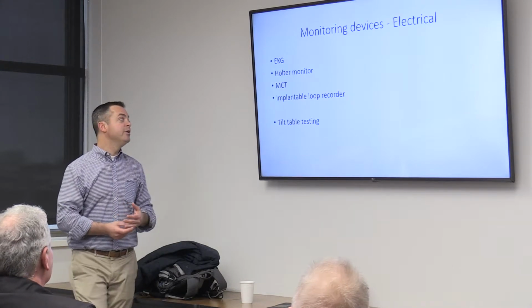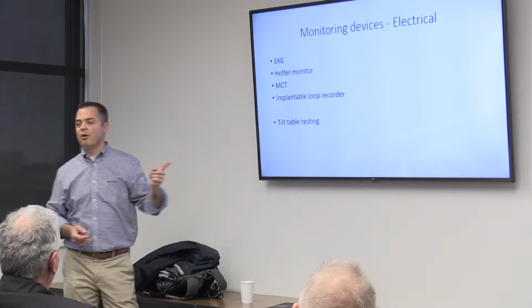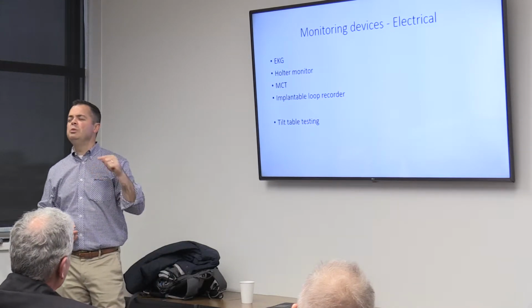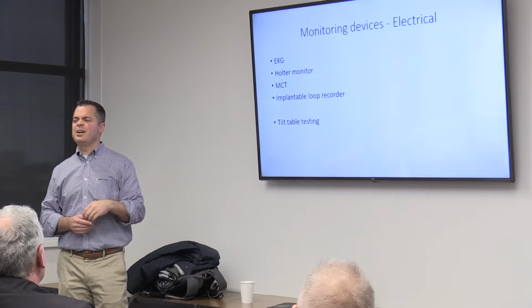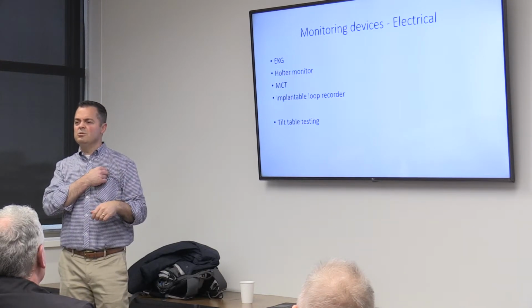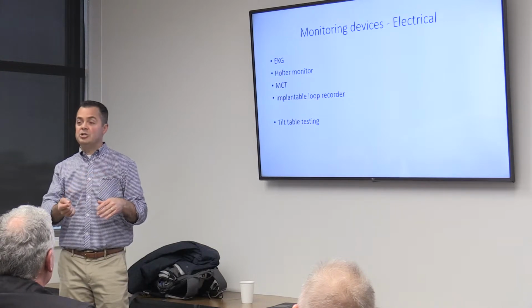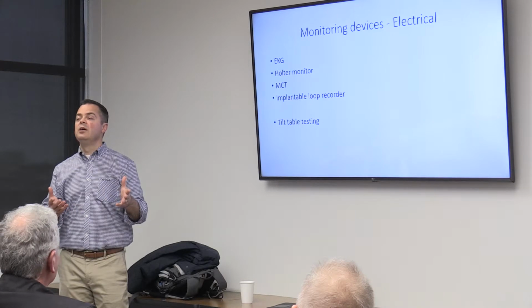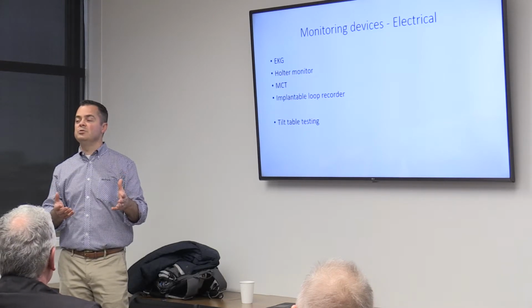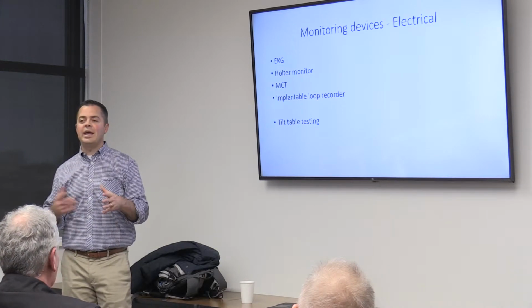So these are really cool. We just started implanting them here in our office. I mean, you'd be blown away if you saw one. It's just under the skin. There's not even really any stitch. We just use a little glue, and then it sits in there. Now you've got to come back and get it checked every so often. But it can be a very useful tool, I should say, for people who struggle with, we can't catch it.